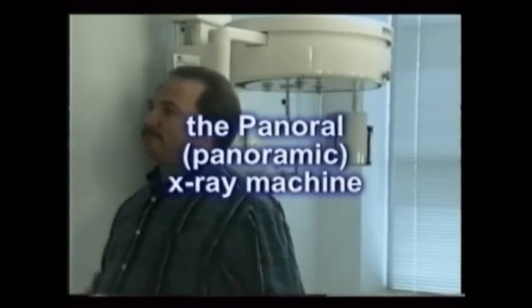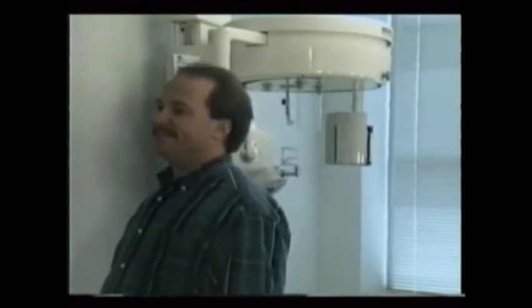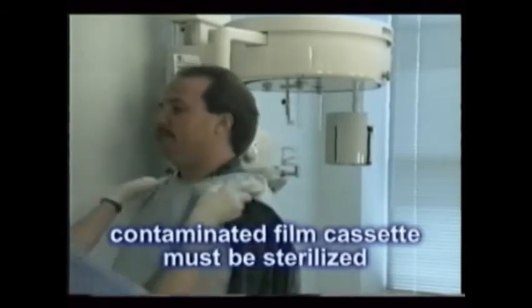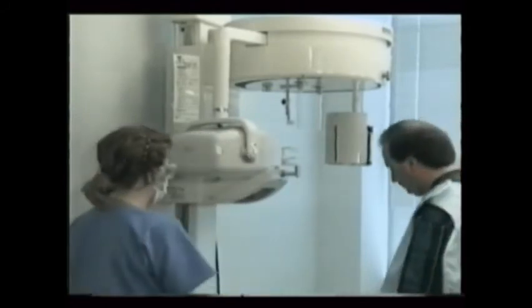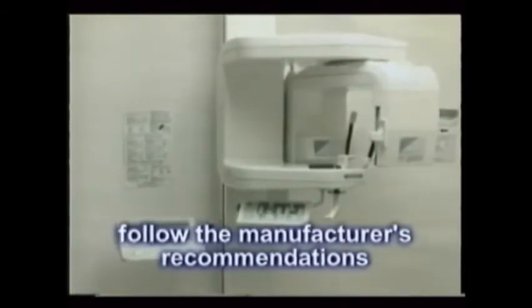The panoral x-ray machine is prepared much like a treatment area itself — it's disinfected, and the film is loaded before placing the patient in the machine. This is important, since a film cassette that becomes contaminated with saliva or blood must be sterilized or disposed of, and sterilizing the cassette is extremely difficult. Every panoral x-ray machine has its own operating procedure, so be sure to follow the manufacturer's recommendations.